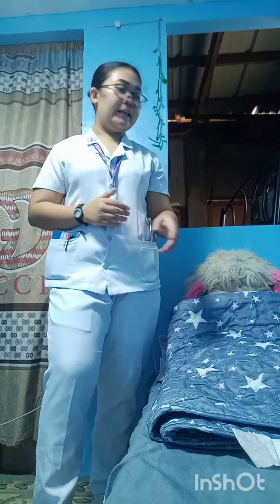After those assessments, we're going to assess the top of the client's ears if there are any signs of irritation regarding sa paglagay natin ng cannula tubing. Pero if present yung irritation or lalo na yung mga redness and rashes sa top ng ears ng ating patient, you can pad a gauze pad to help relieve the discomfort of the irritation or the rashes of the patient.